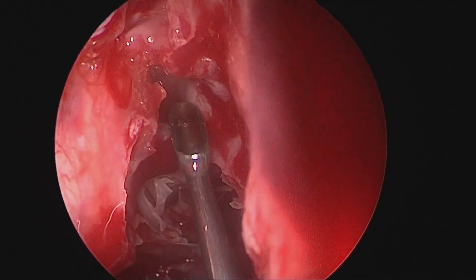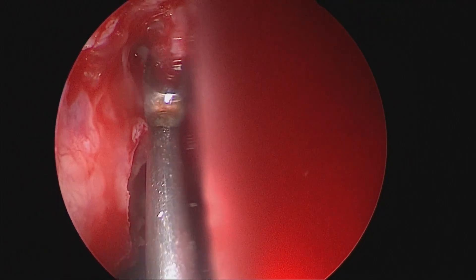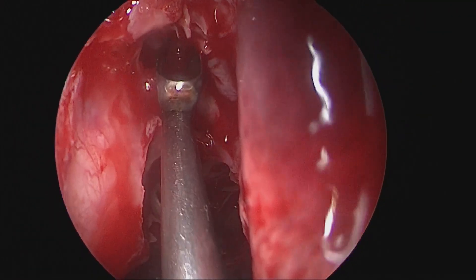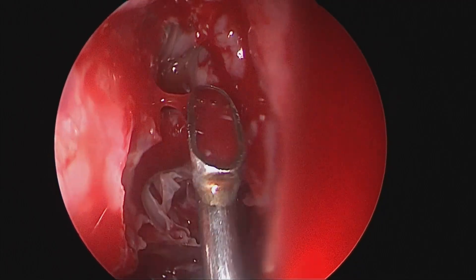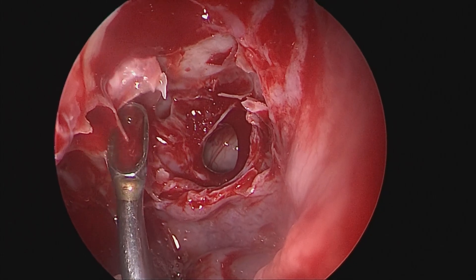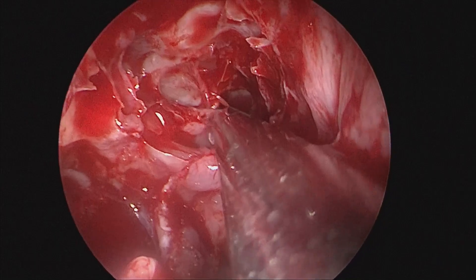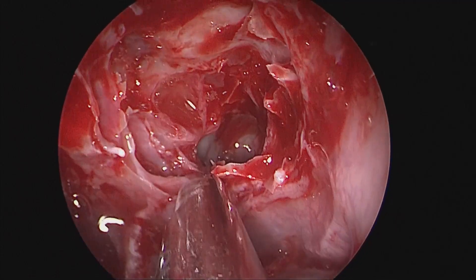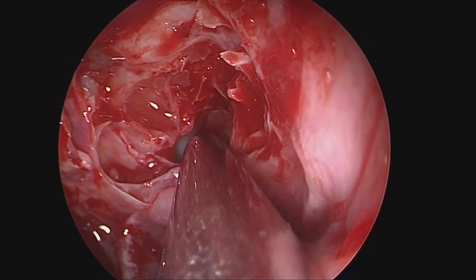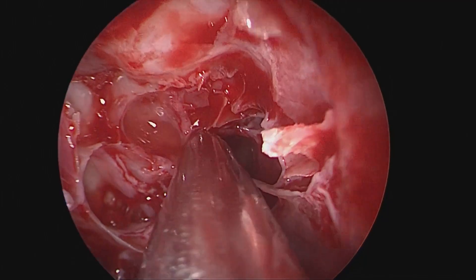We come back to the frontal recess area and take down the posterior wall of the agger nasae, followed by septations from the suprabullar cell, making a point to fracture these cells from posterior to anterior so that our instrument does not have any possibility of hitting the thin and fragile skull base at the cribriform plate. Having a clear vision from the superior wall of the sphenoid to the frontal recess is very important in maintaining overall perception of the slanting skull base. Here we are opening the sphenoid widely, removing excess edematous mucosa and some thin bony fragments.